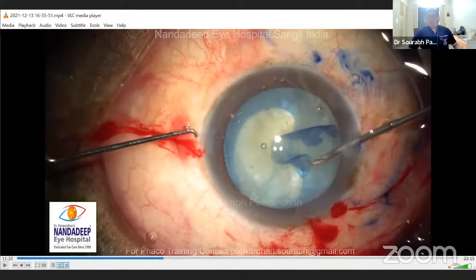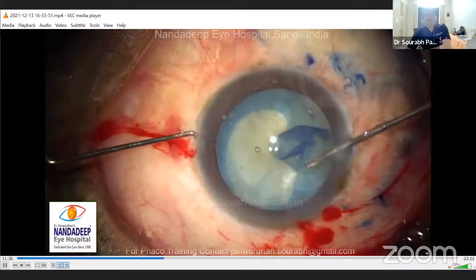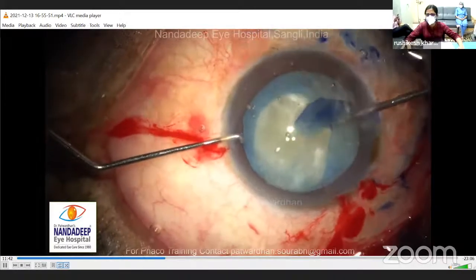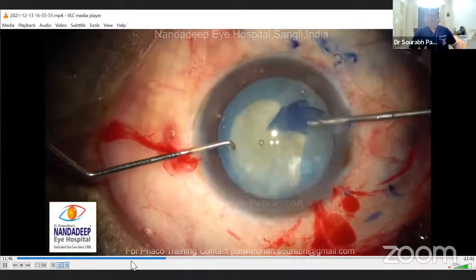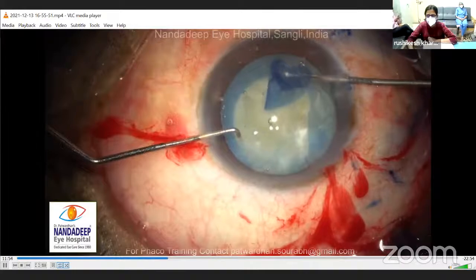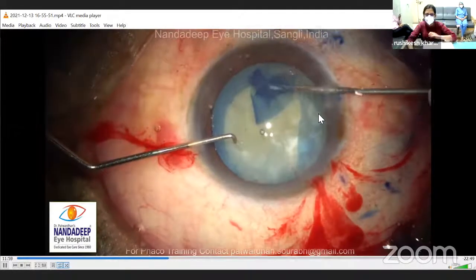Yeah, now also I think you should go ahead with the forceps only. Cystotomy is good when the anterior capsule is convex and there is no intumescence. If it is concave, like even in Morgagnian cataract, if the capsule is not proper, there is no support, then cystotomy you can do, but it's very awkward to complete it and you don't have proper control. Yes, sir. So you have to continue with the microforceps. Yes, sir.